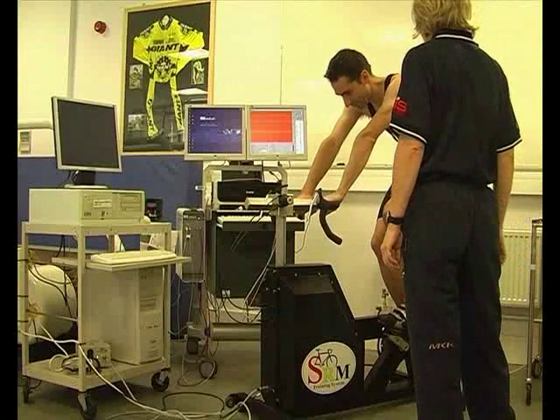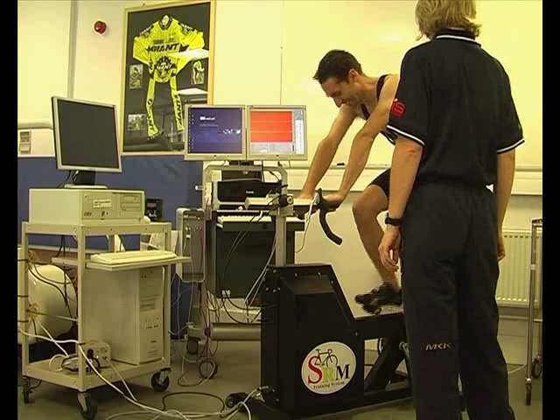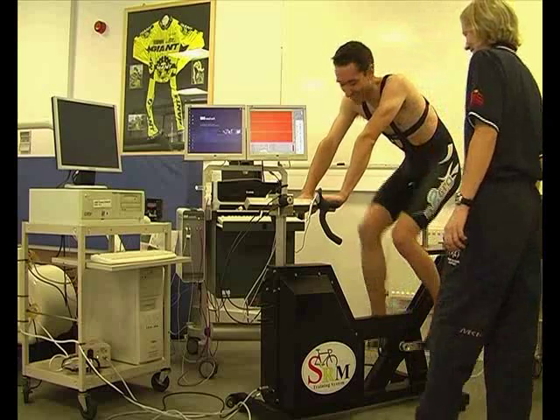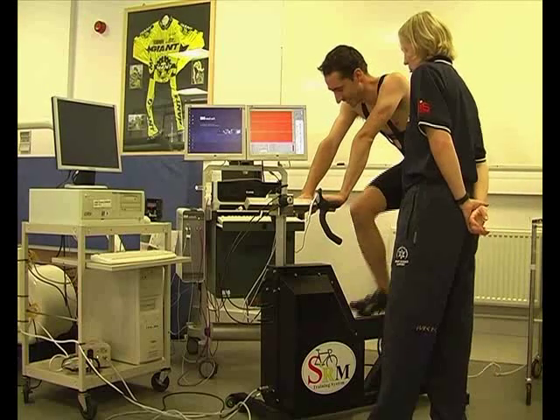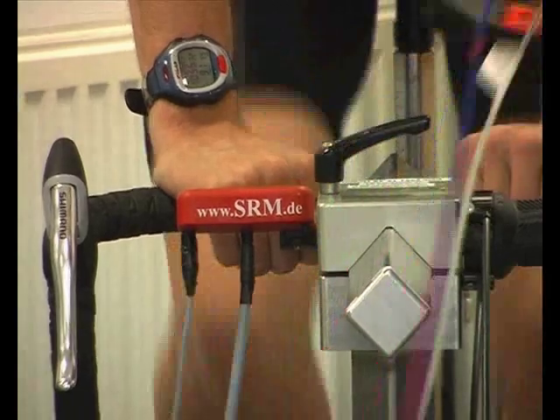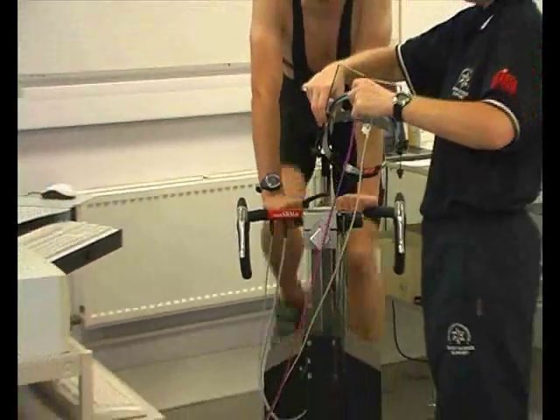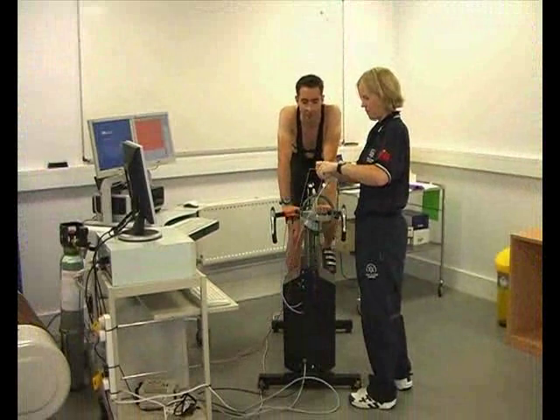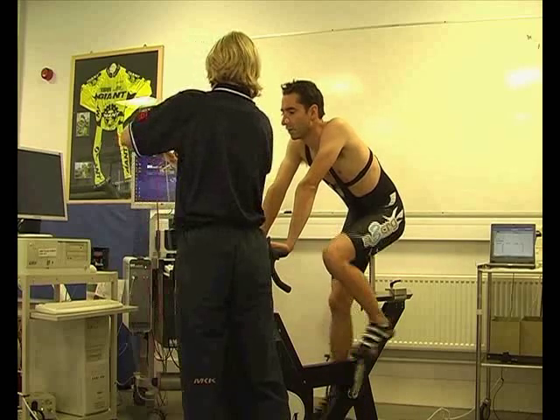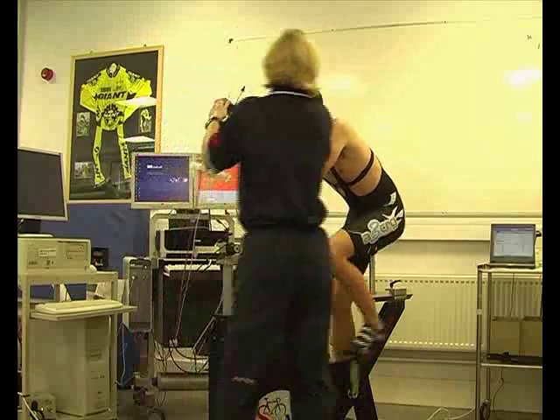Before the athlete starts the test proper, it's always good to let them have a chance to get going on the bike, just to check that everything is okay and the setup's to their liking. Although this test is designed to measure lactic acid in the blood, it's also worthwhile measuring oxygen uptake during the test. This allows us to look at the cyclist's efficiency and how economical they are. For this reason, we ask them to breathe through a mouthpiece arrangement.